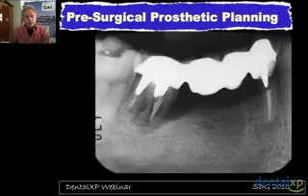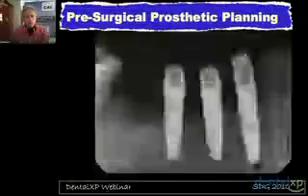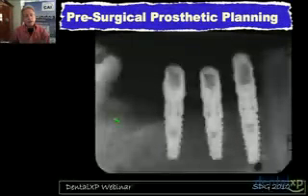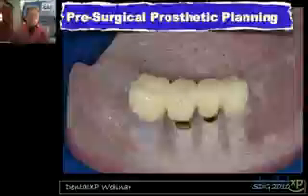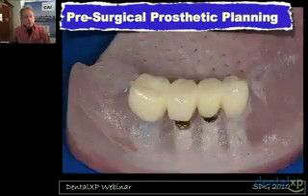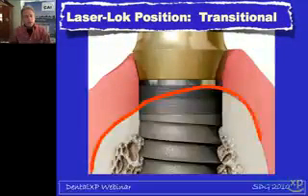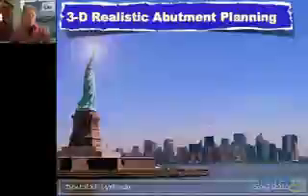And so, patient, again, to remind you, walked in like this with a defect, and we're going to extract, place 3 out of 4 implants, and bone graft in the area where the molar is. About 5 months later, we're going to come back, we'll put a new implant into where the molar is, and then we'll finish the case. So again, new paradigms: 3-dimensional planning, the use of model-based surgery with stereolithography, and understanding the transitional placement to maximize the design of the implant that we're going to use.